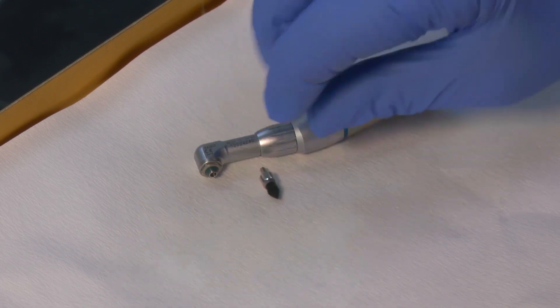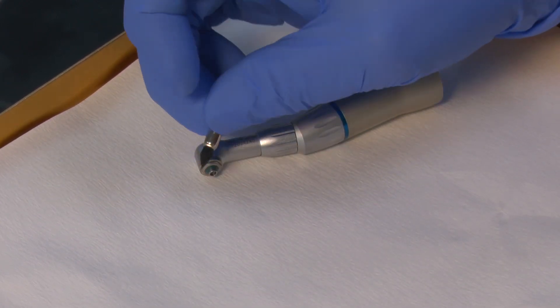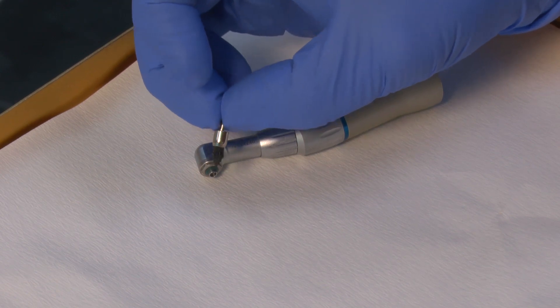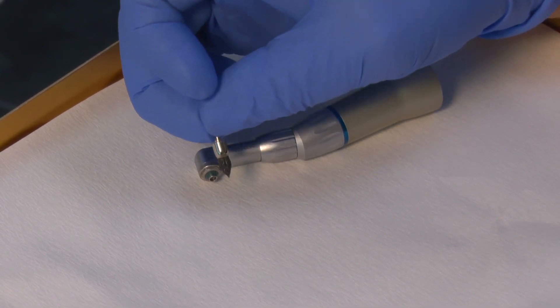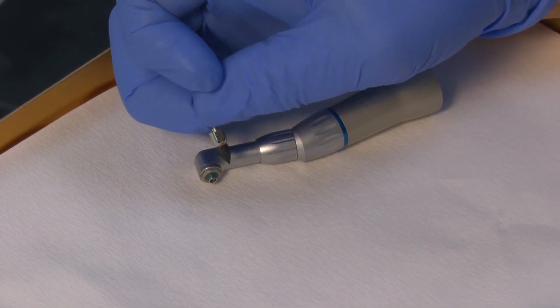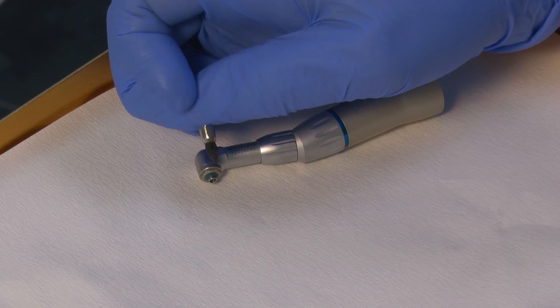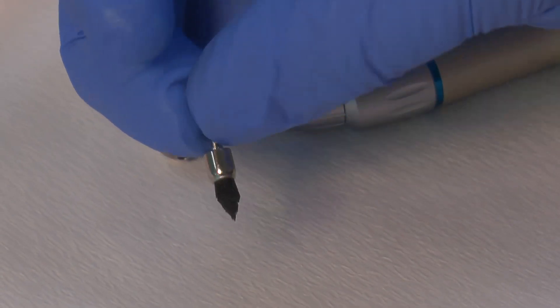Even better for tight spaces is this black tiny pointed brush — it's just ideal for getting to the edges of the teeth to take the stain. But remember that we aren't over-polishing teeth these days; it's a cosmetic treatment. You don't have to have an air polisher to remove stain if you've got a couple of these other things that you can use.